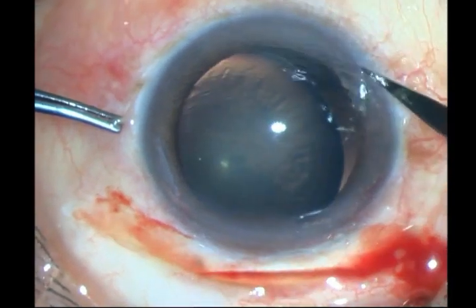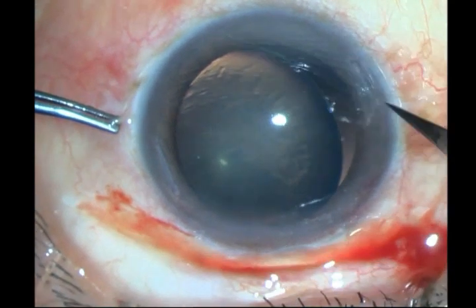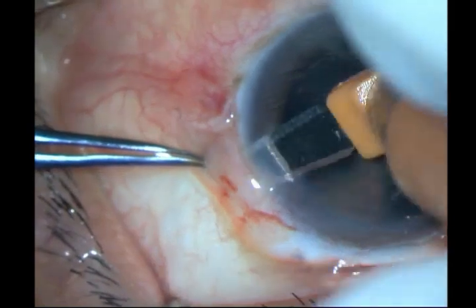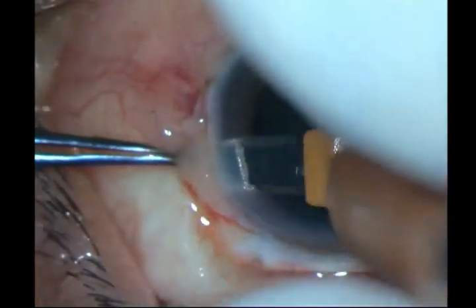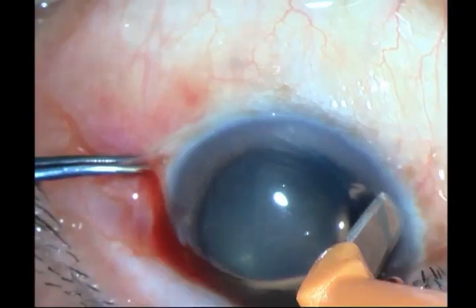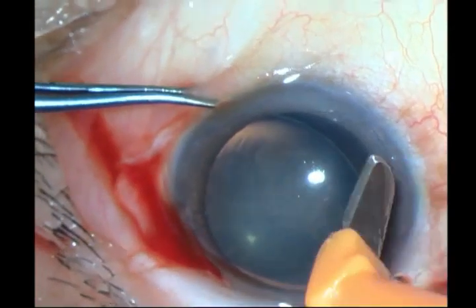Here I am fashioning my Hoffman tunnels 180 degrees apart. I like doing this rather than the scleral flaps — although the scleral flaps are easier, you have to do a peritomy and you have to raise a flap.